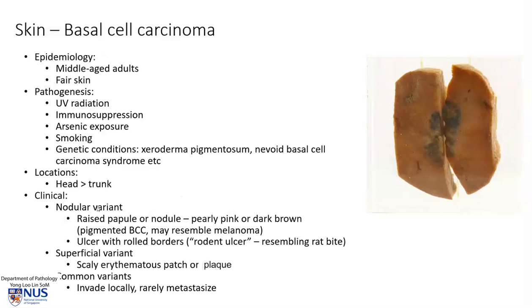Clinically, there are many variants. One of the commonest variants is the nodular variant, which usually appears as a raised area or a nodule on the skin. It can be pearly pink or dark brown. As you can see here, this is actually quite dark in colour, and this often occurs in the pigmented basal cell carcinoma.